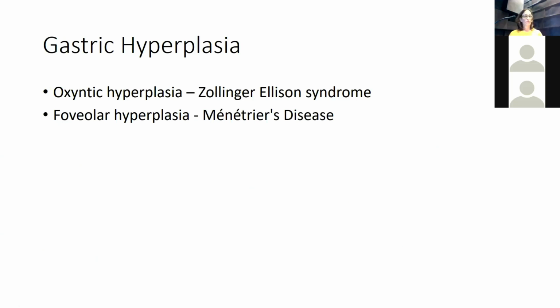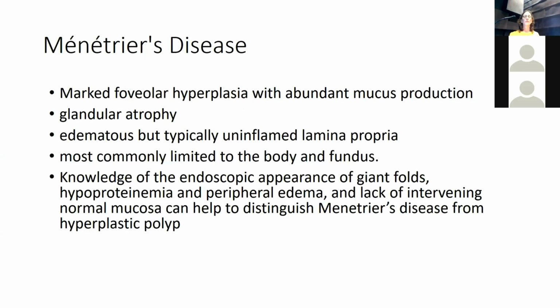Okay, so we talked about oxyntic hyperplasia. I'd like to flip over the record and play the other side with a little bit of commentary on foveolar hyperplasia, which will then lead us into other lumps and bumps. Those of you who are a little older remember Ménétrier disease in its pure form, not the fake form caused by cytomegalovirus in children. You see this massive gastric foveolar hyperplasia, and it just pours out this nasty, goopy, mucousy protein, and then the patient becomes hypoproteinemic because their stomach won't stop drizzling all their protein.